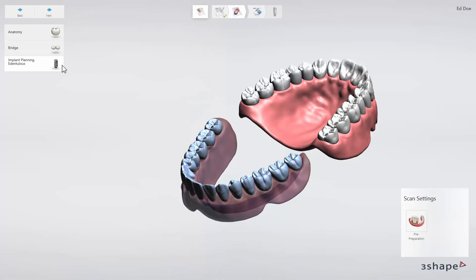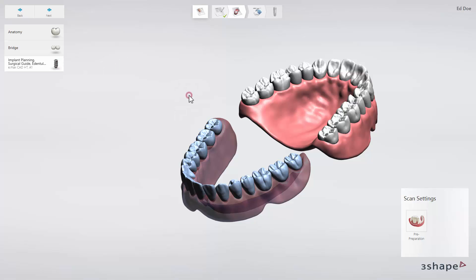Select Surgical Guide if you want to design a guide for this case. We have now created an Edentulous case and filled out the order form. Click Next to proceed to the Scan Import page.